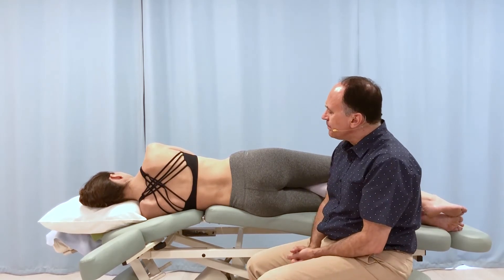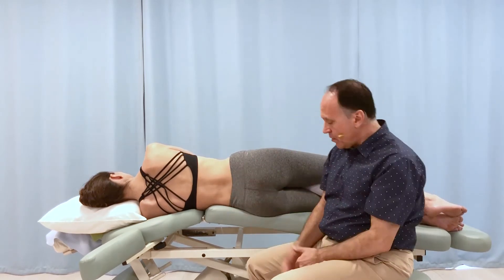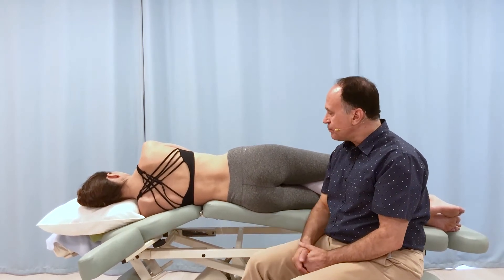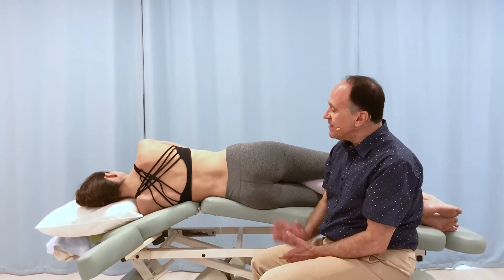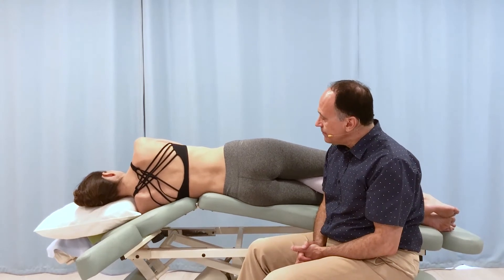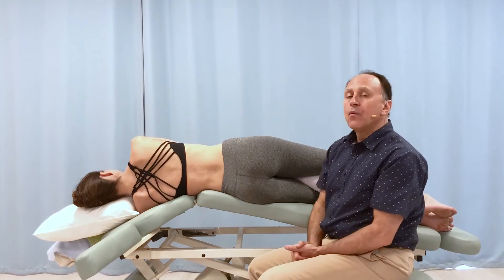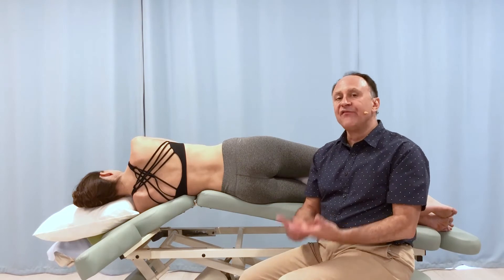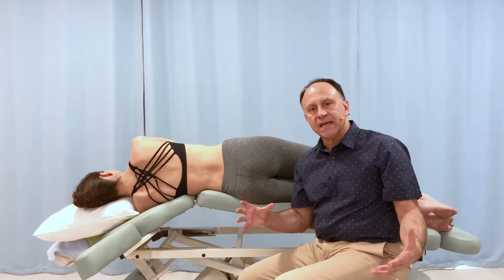When she's comfortable, if I were working with bolsters I'd have to have her get up, take a bolster out, and put a larger bolster in. But with the lateral flexion break feature, all I need to do is press on the foot pedal a bit and bring her up some more, letting her stay there until she's comfortable. I can then bring her up even more, making sure she's comfortable at each level. You never want to challenge the client's body too much or force a stretch into their body — you need to give them time to accommodate to it.